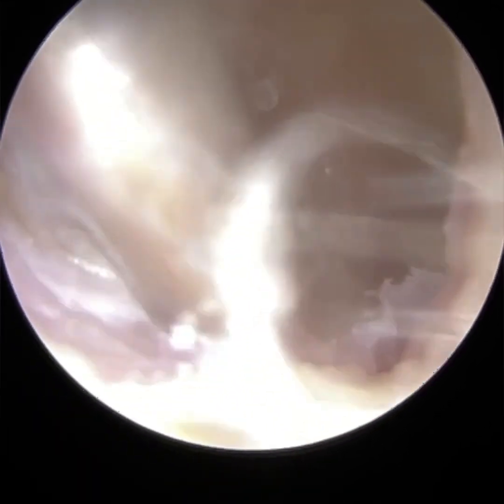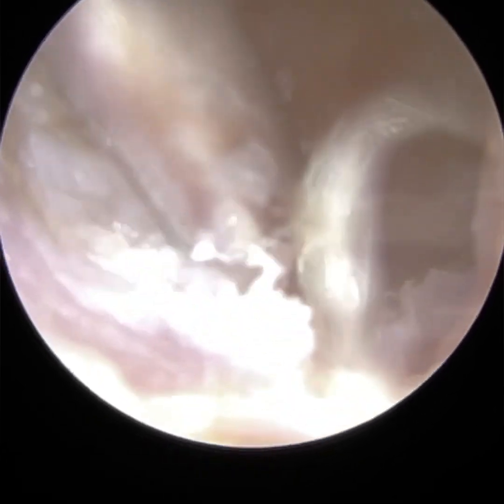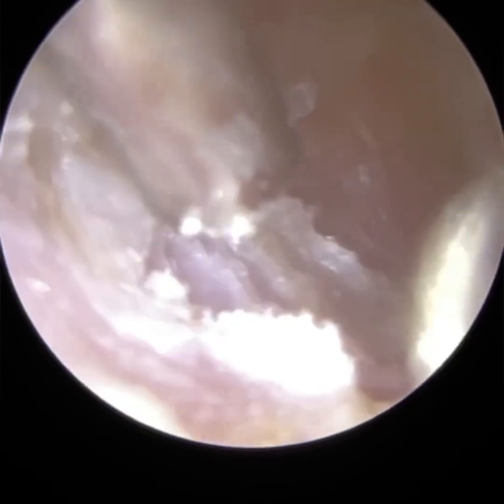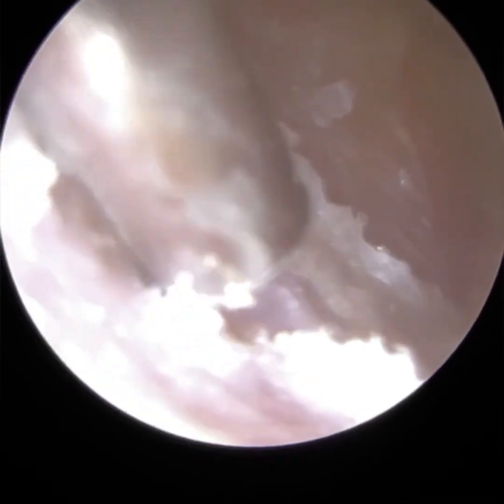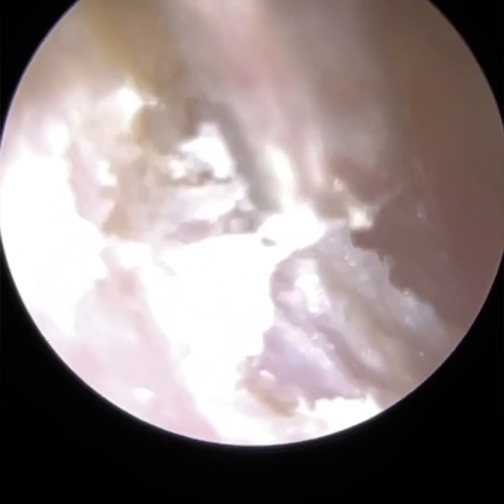Now, this patient has got a very narrow ear, and I suspect they've got narrow orifices such as the eustachian tube, so it's a chronic problem this patient has got. So for them, their eustachian tube just doesn't open, or if it opens, it doesn't open for long enough or wide enough. And that means there's always a shortage of air in the middle ear.